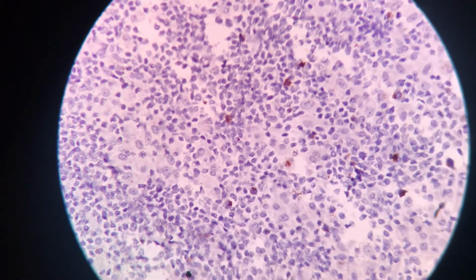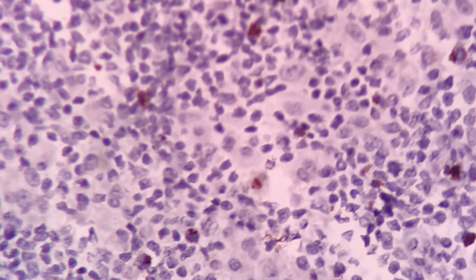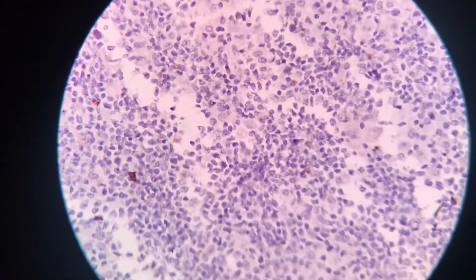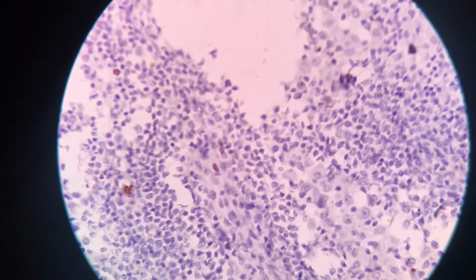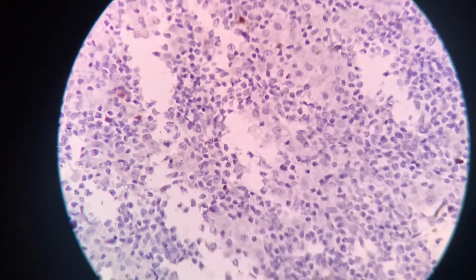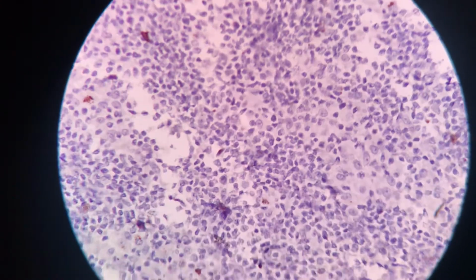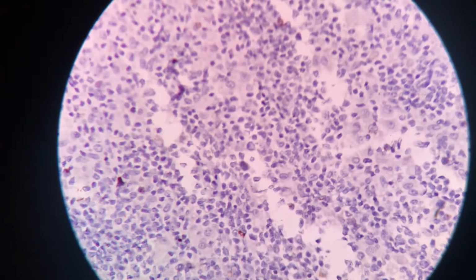You could see that some of the cells are getting very faint hue of staining. Some of them, or rather many of them, are granulocytes, and we actually could pass off this case as lymphoma unclassifiable, but Hodgkin lymphoma was the nearest possibility that was conveyed. The patient has been treated with the usual line of management of Hodgkin lymphoma, and he has recovered completely at the end of 6 cycles of chemotherapy. The follow-up would be interesting in this case.